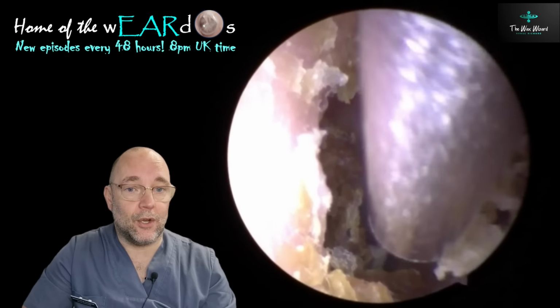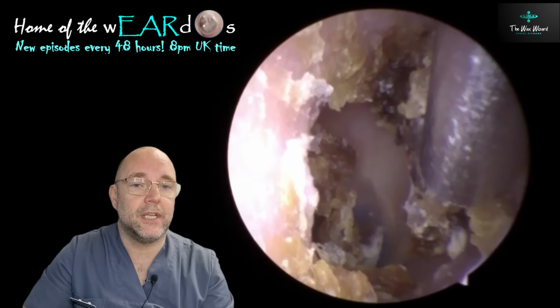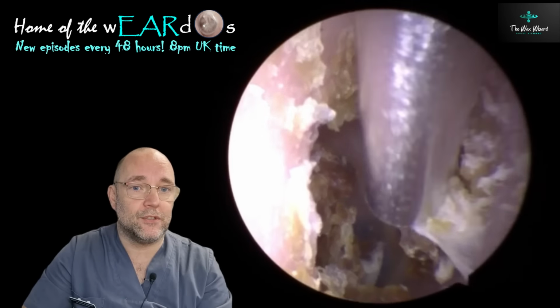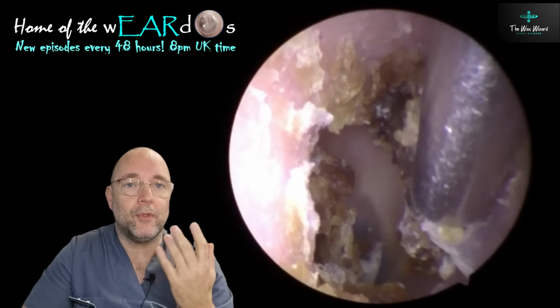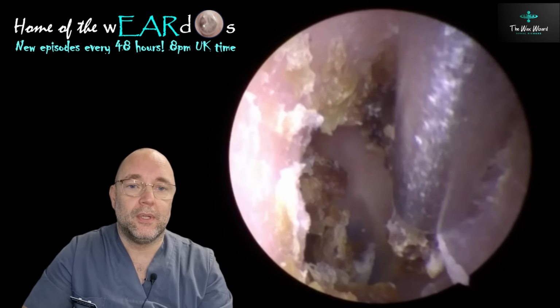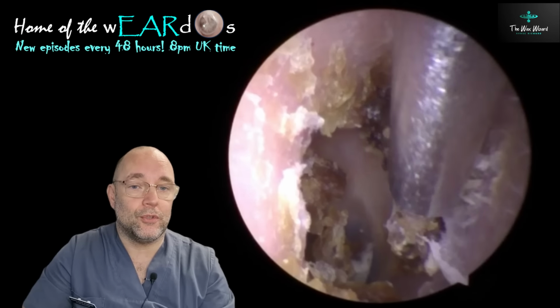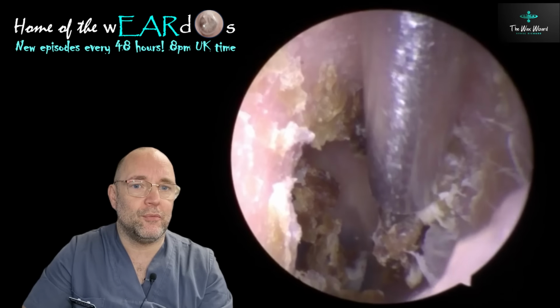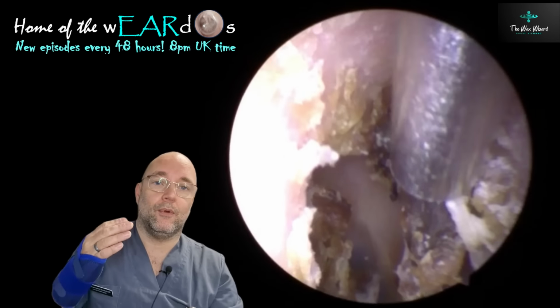And the reason why I didn't oil it was thinking, well, why on earth didn't you oil that? Because of how dry it is, it would have been easy to get out. Yes, it would have done. But he relies on his hearing aids quite a bit. And if you over oil someone's ear and then they put their hearing aids in, it clogs everything up. So, I mean, it came out without the oil. It just wouldn't have taken as long with it. But if someone wears a hearing aid, we try and avoid it if we can, especially if they rely on it quite a lot. So yeah, what have I done here?